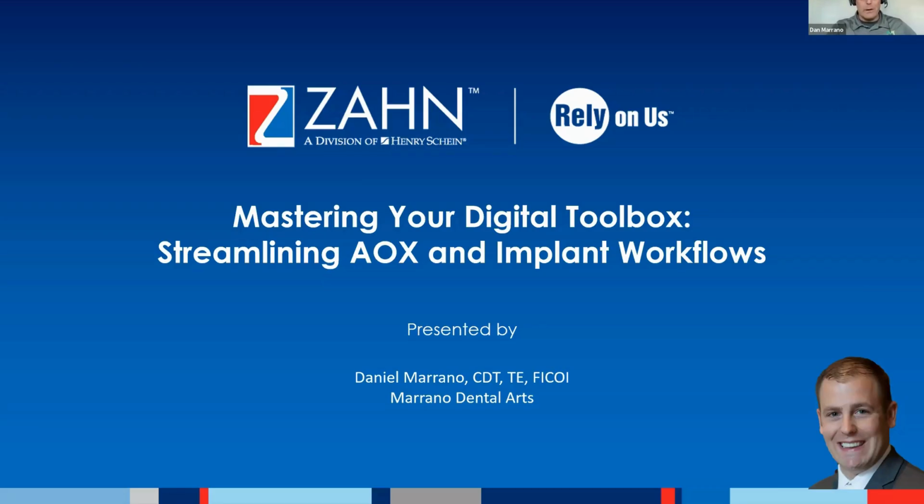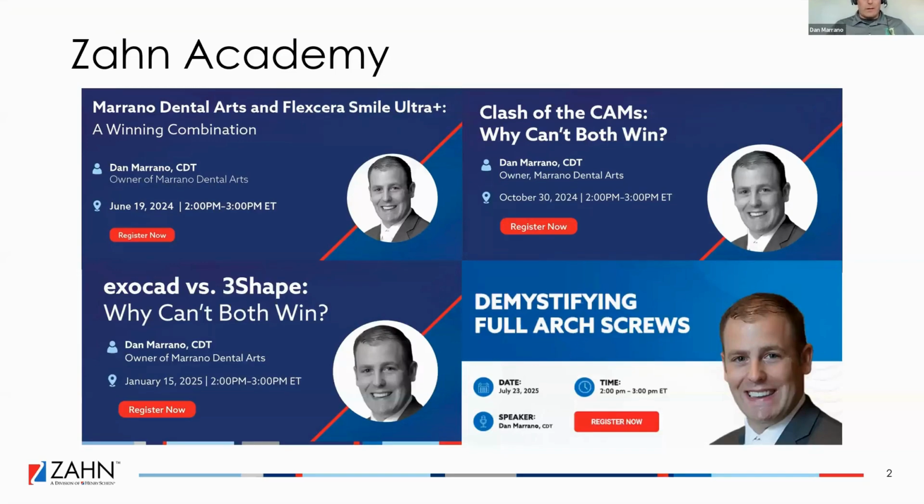I want to get right to it because it's a combination of all these previous webinars we did, these four, with some additional information. You could probably talk on this for an entire day, minimally 3 or 4 hours. That's not a joke. So we're going right at it with tons of information coming at you. The good news is we have a lot of slides, so you can come back and check it out later on the recording when they send that out.